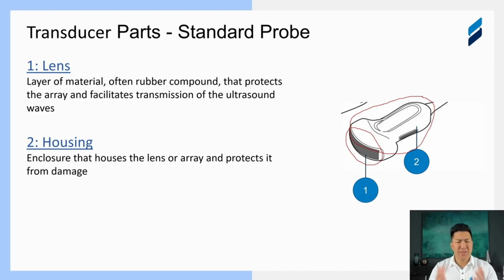So check where there are adhesives and seals to make sure there are no gaps, and if there are any gaps, they can easily be repaired. This serves two purposes. It protects the electronics on the inside and seals them from the patient, which is a little less critical than the lens, but it is also where a user will be holding the transducer to scan a patient.